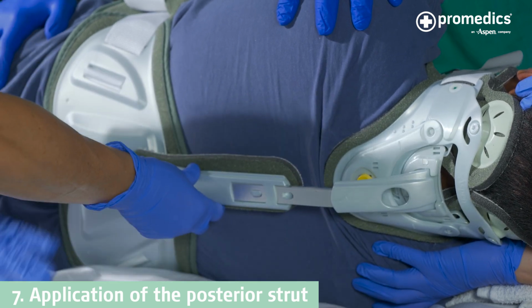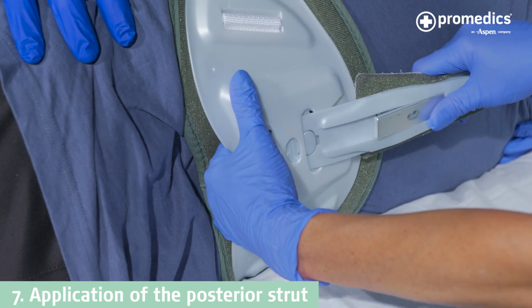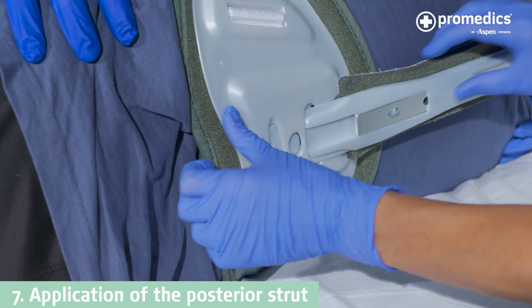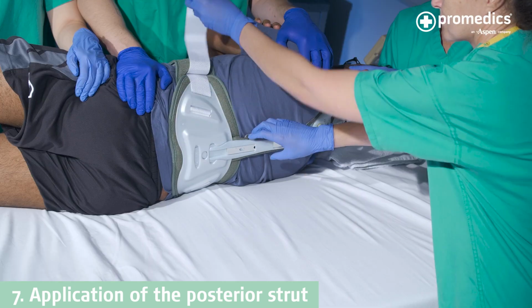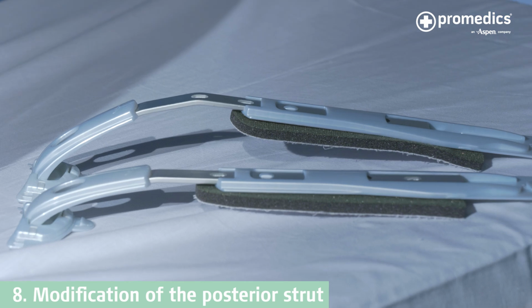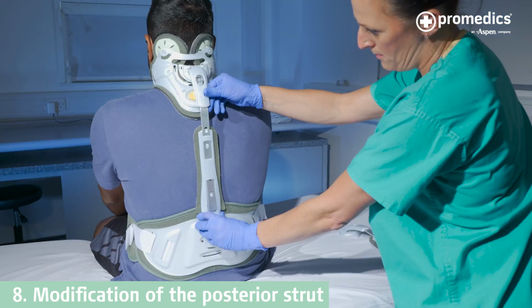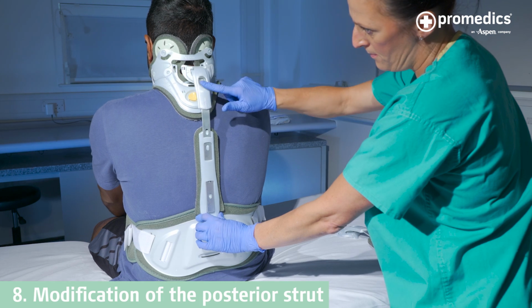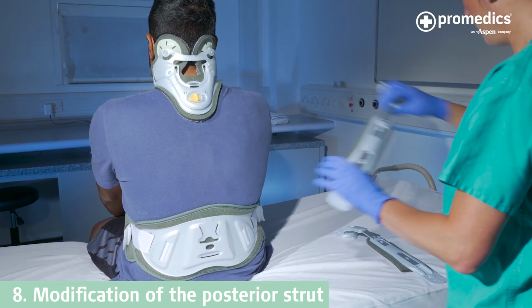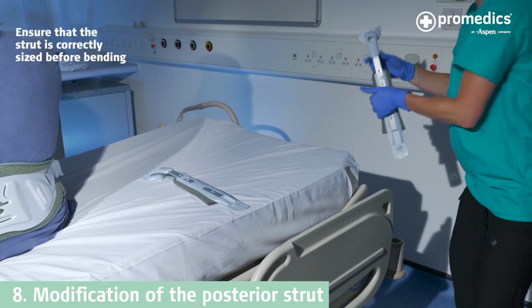Place the lower section of the strut into the slot at the bottom. Use your alternative hand to guide the piece in from behind the brace. Ensure this is locked in place. The posterior strut can be shaped and adjusted as shown in the video to suit the patient's anatomy. To do this, we bend and adjust the bar on the edge of a table or hard surface.